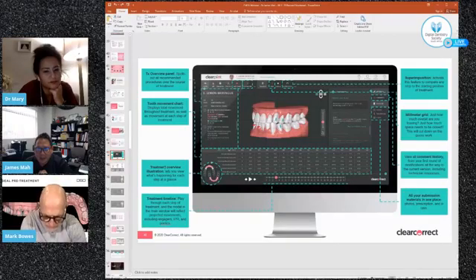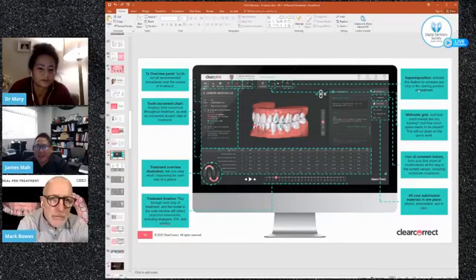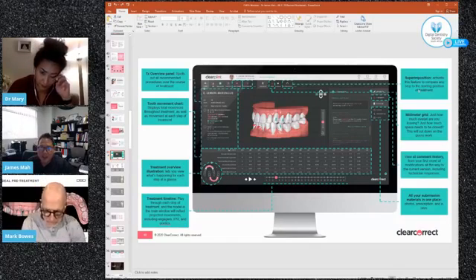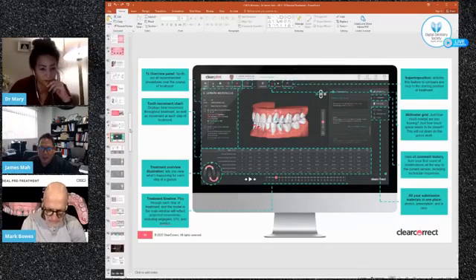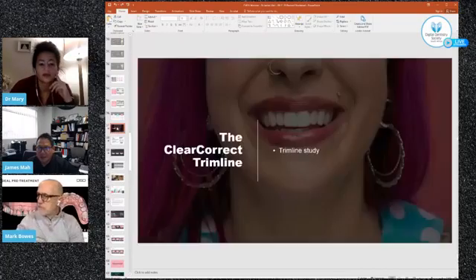The tools that I really like is down here, the treatment overview illustration. It shows you which teeth are active in the lower left. There's also the tooth movement chart here. Those two, and the superimposition tool, are what I use the most. The superimposition allows for a comparison of any step to the starting position of the treatment. But it's nice that everything is there, and as you're rushing around between patients, you can easily get the information you want out of the software. So I really like that new feature.